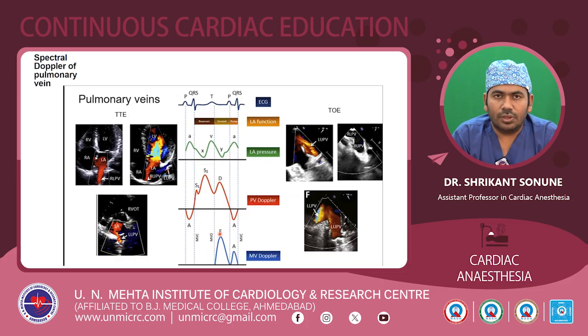and it is a forward flow. And the diastolic or D wave is present in the pulmonary vein Doppler waveform, which correlates with the diastolic phase of the cardiac cycle, and the same comparison will be seen in the mitral valve inflow tracing, which is compared with the D wave of the pulmonary vein Doppler.